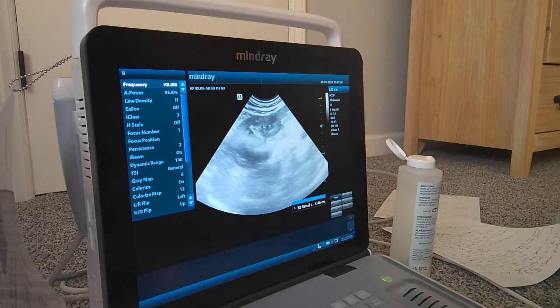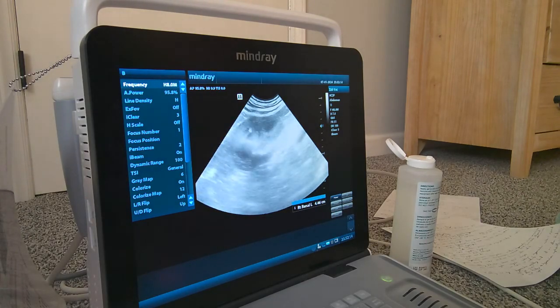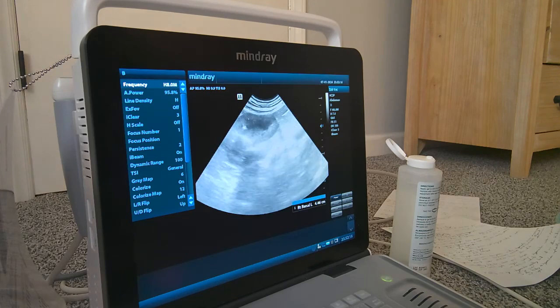Different changes that we can see. Renomegaly, if I start seeing really, really big kidneys and maybe a small liver, making sure we don't see any evidence of a shunt anywhere or something we can look for.